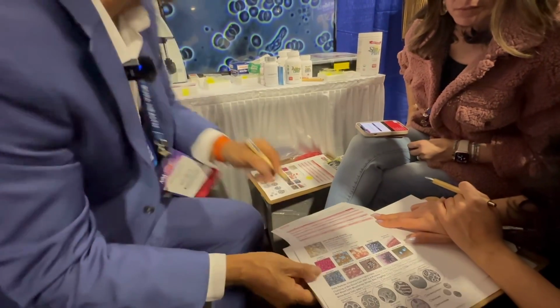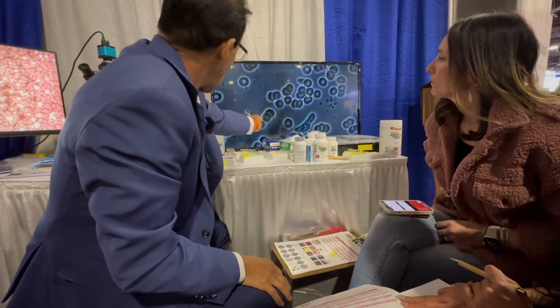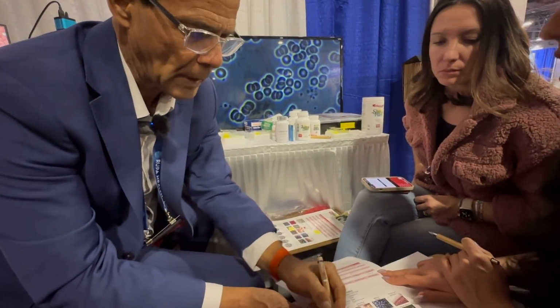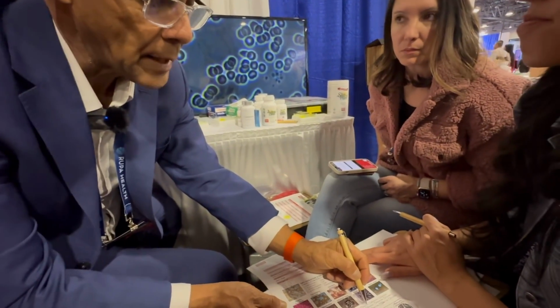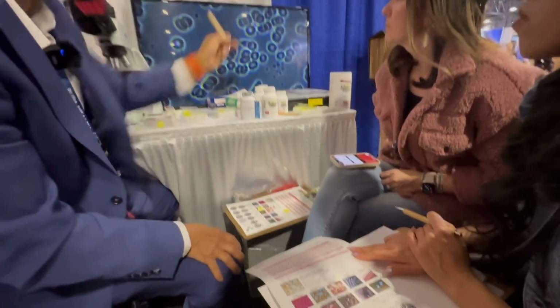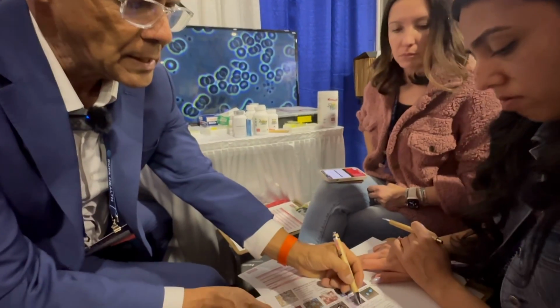Is there fatty particles in the blood? Everyone has a little fatty particles. I note it within the normal range. What have you eaten this morning? I had like avocado toast with eggs and lox. Eggs and lox, okay. So it hasn't caused any clumping. The cells have just landed on top of each other. But if they get too high, it'll clump.